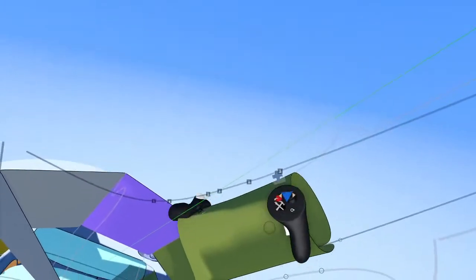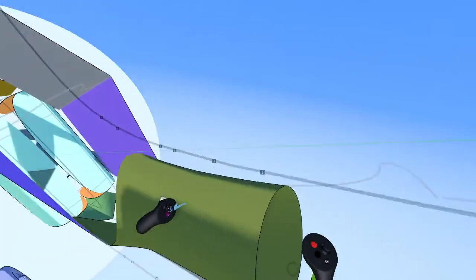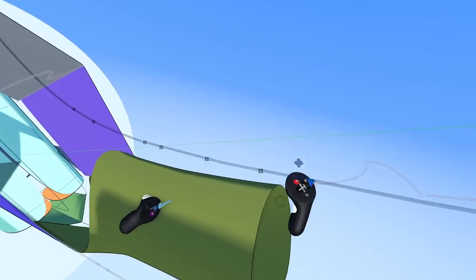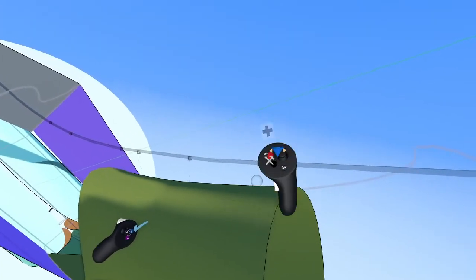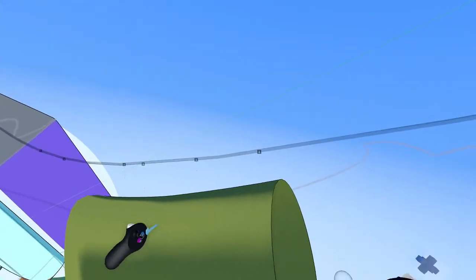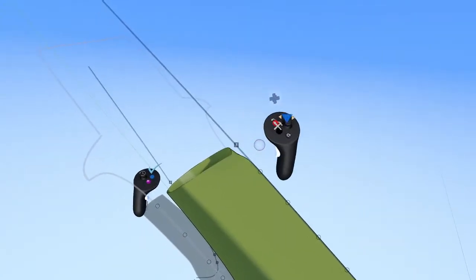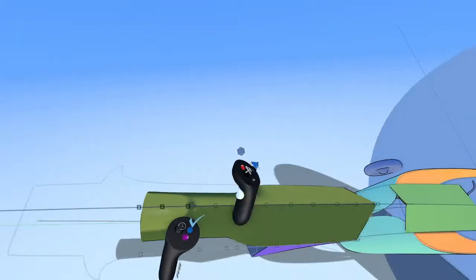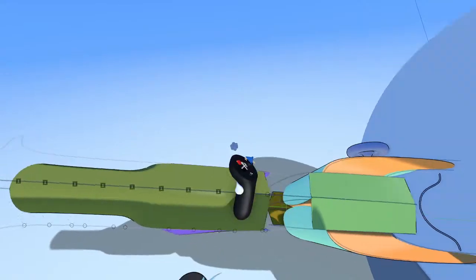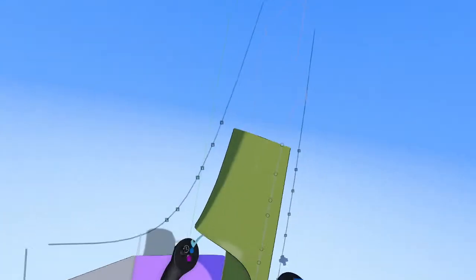Now, on this side here, it's connected across the mirror plane. We've dragged the edit points and connected them across the mirror plane, and we get this new piece of UI, this new icon here of a black square with a keyhole in it. On this side, we don't have that. But if we take this and just shift it a little bit, it's connected across the mirror plane. And so you want to make sure you do that so you can see the smooth nature across the mirror plane there.